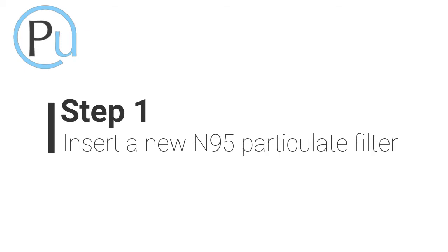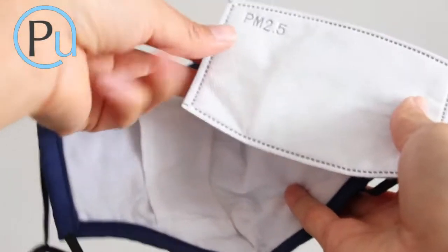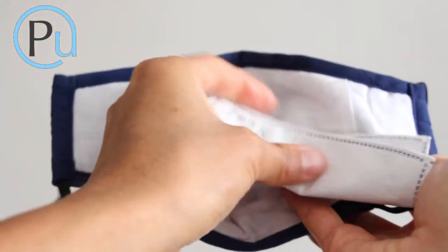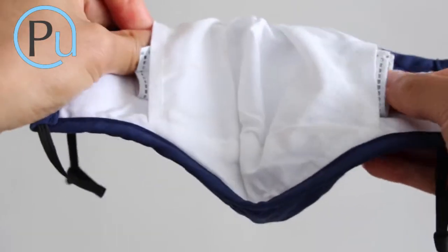You'll get a text message alert. When that happens, here's what you do. Take a new N95 filter from its package and insert it into the mask. It's easiest if you fold it, then smooth it out once it's centered.